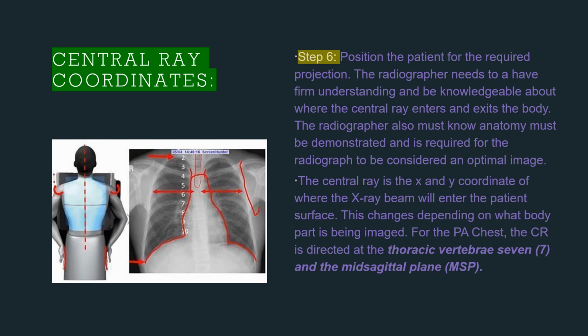Also, step 6 is all about central ray coordinates. Where are you actually aiming those x-rays that are being created and emanating from the x-ray tube? Where are you actually aiming those?